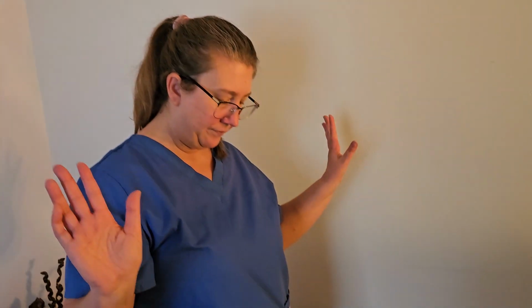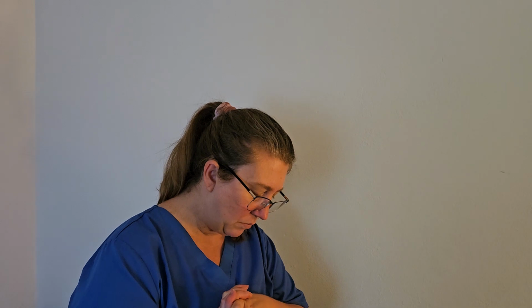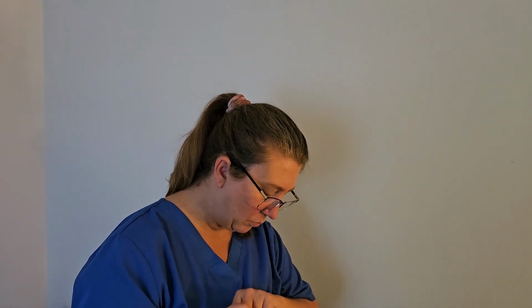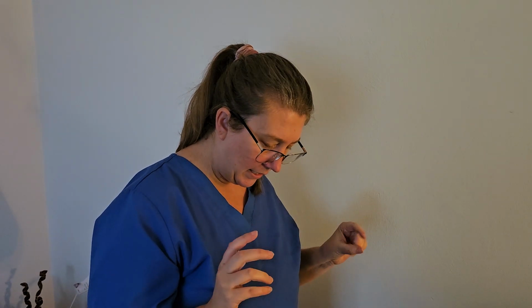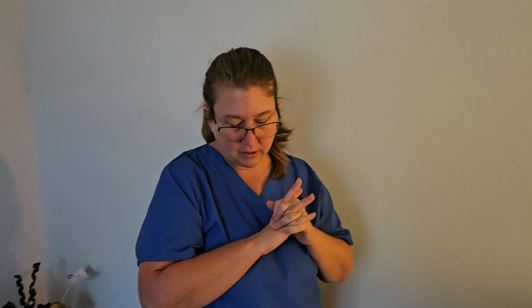All right, now we've got our medication ready. We've got our needle ready with the right size, the right gauge, the right amount. And we did our 3 safety checks, and the third one, of course, depends on the facility that you're at. So we are ready to go to our patient.